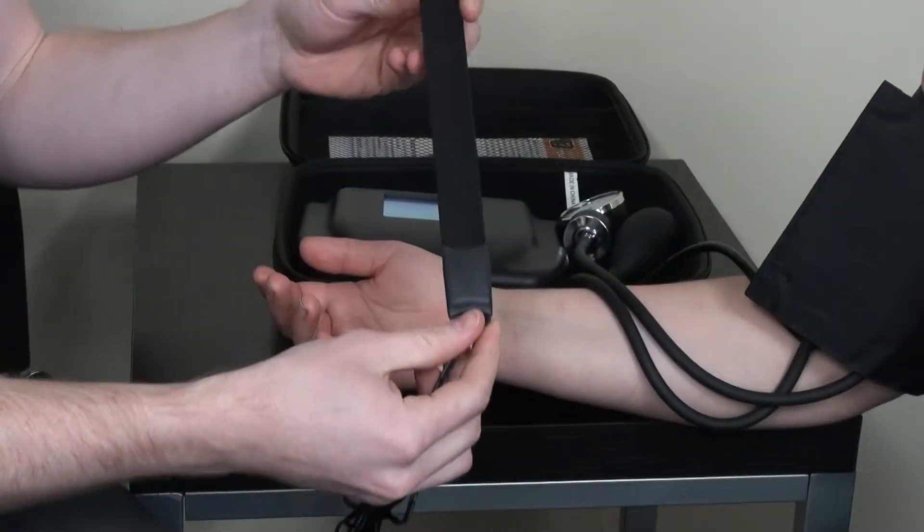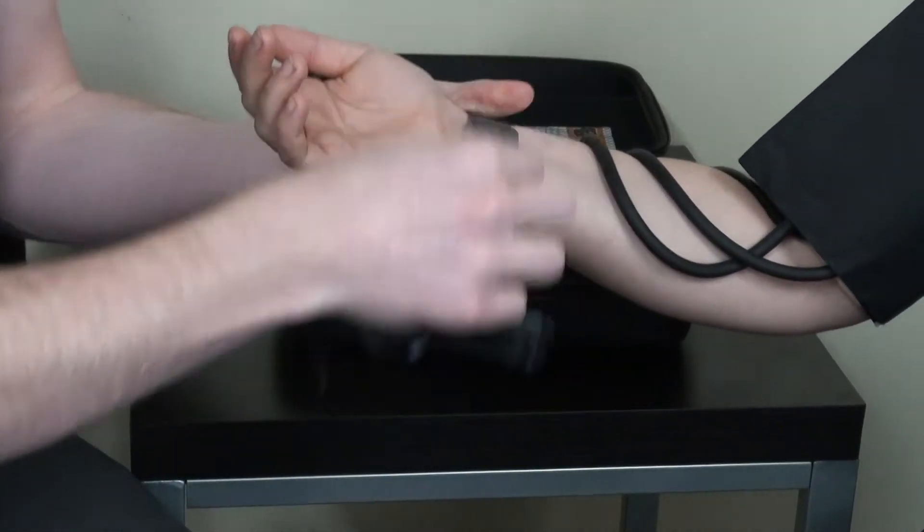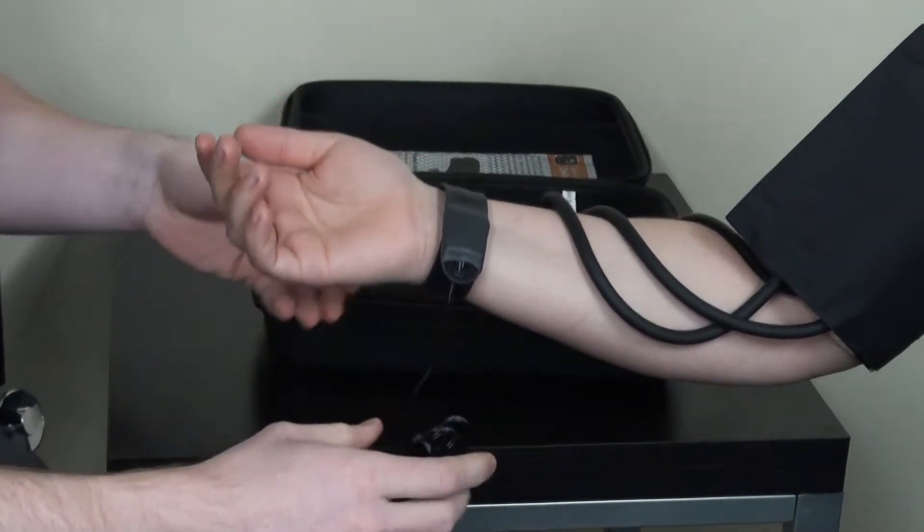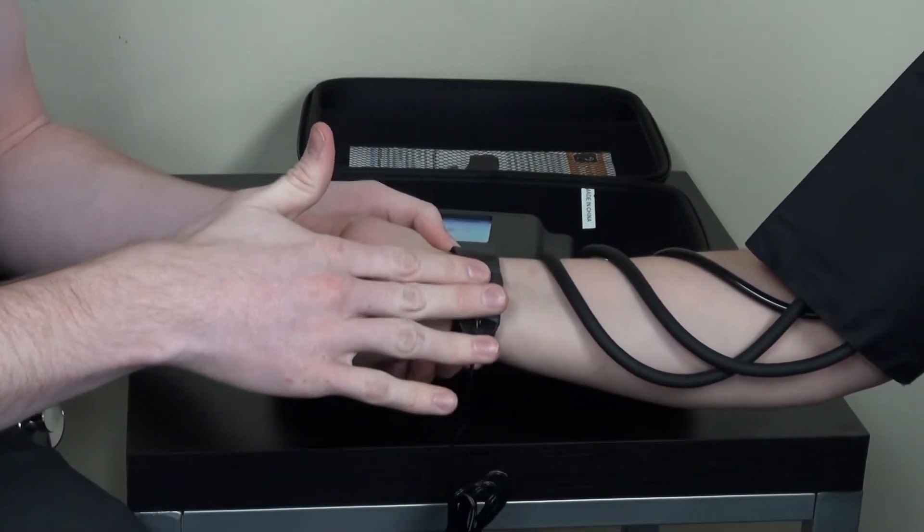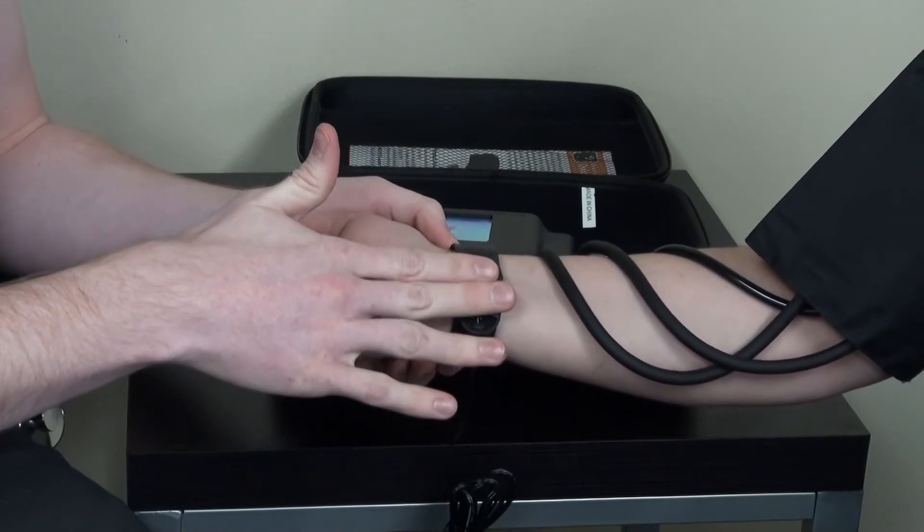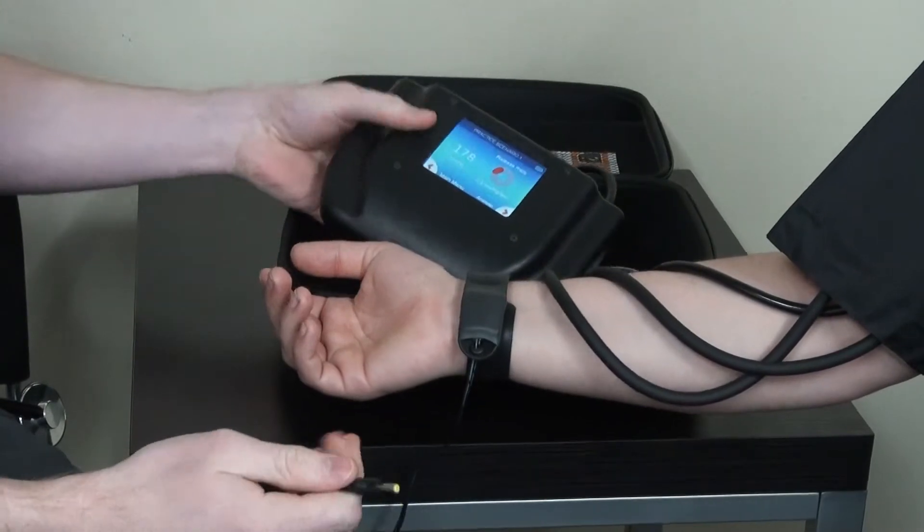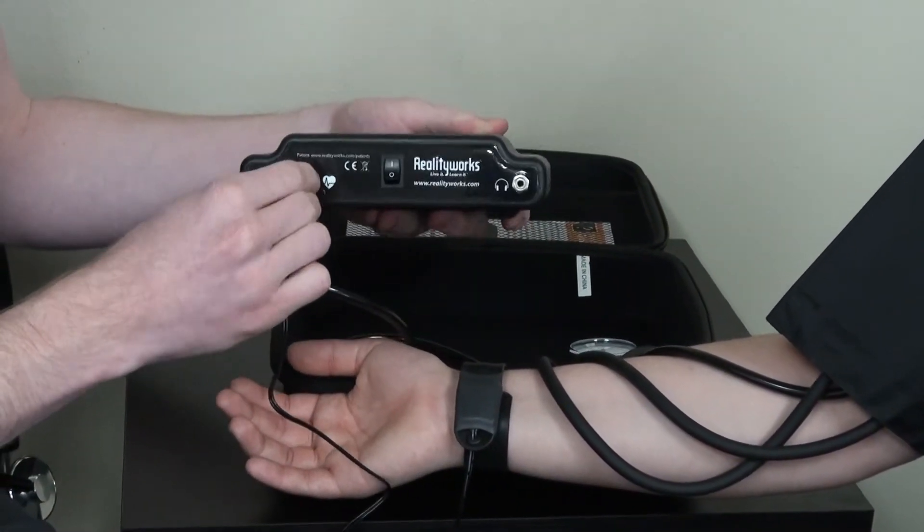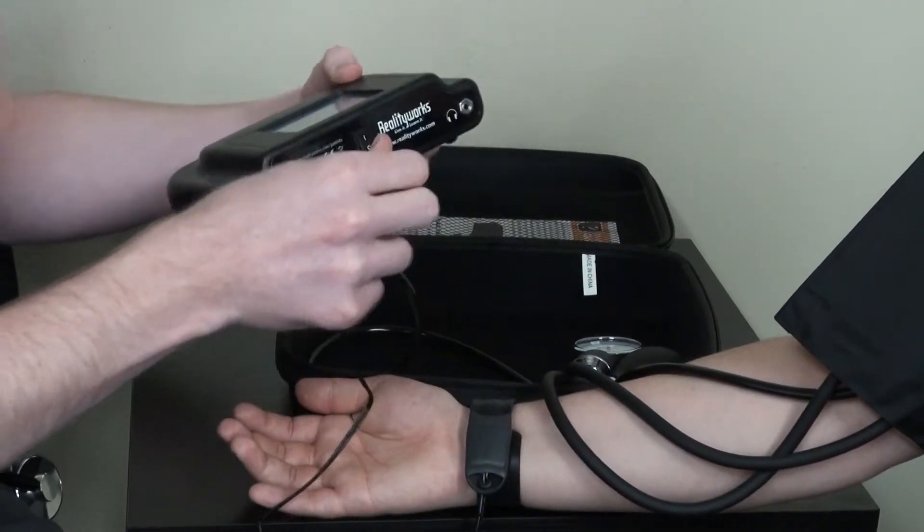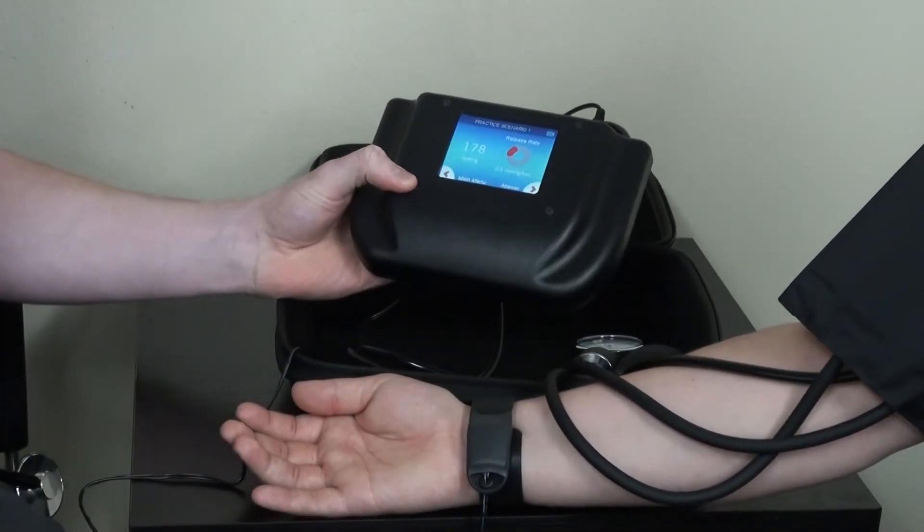We also provide this pulse band that simply snaps around the wrist of the patient and provides tactile feedback for the radial pulse for measuring blood pressure through the radial location. The radial pulse band plugs into the back of the box just like that and can now be used in conjunction with the cuff.